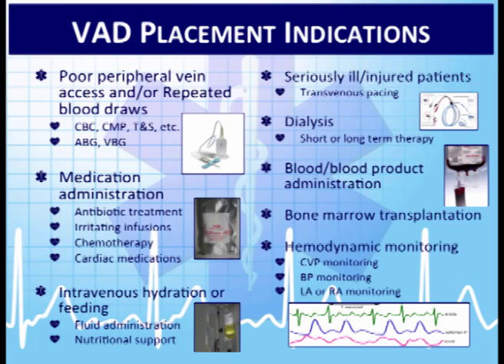They may get a device put in that can be accessed each time they come in for chemotherapy, but then is kind of hidden when they're done with that chemotherapy. I added cardiac medications because for the paramedic services and critical care paramedic, there's some patients coming out of St. Luke's and I believe Frederick Hospital that are on cardiac medications, and you're going to see they have their own little pump, and it may be going through a central line. Those patients need that to be able to sustain an adequate blood pressure or perfusion. So that might be a reason that we see that in the field. Those medications we're not touching, we're not messing with. We would take them to the hospital and let the hospital deal with those.